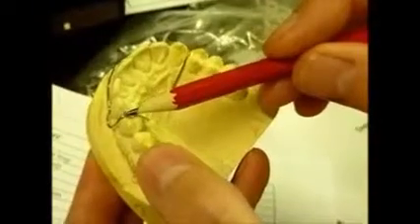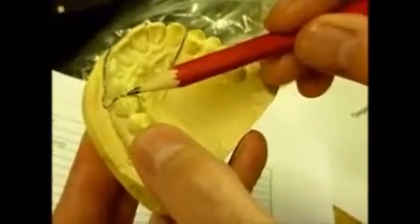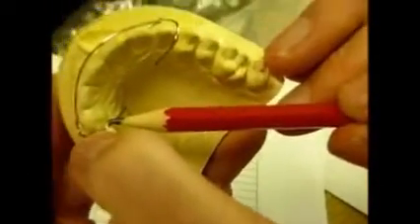Okay. Now the next most important bit again is the tag work going over the contact points, because again this is where the lower premolar is going to bite normally, and it's very difficult to keep this wire work out of the way, and you've got a premolar that's going to come right up in there, and obviously if you've got lots of wire work sticking out, you can't grind it away to get the thing to seat properly. So you have to make sure that the tag work is quite low, as close into contact as possible there. Yeah. And then the same thing for the tag work in the front here, that you need to have the space underneath it to allow the acrylic underneath, but not to have too thick a base plate. Okay. Alright? Yep. That makes sense.